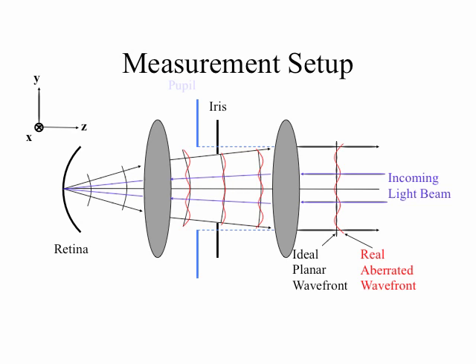Now, the rays of light come off from a single point, and we see our familiar vergence lines here, which are lines that start out at a single point, as opposed to ray tracing lines, which don't. Anyway, these are vergence lines. And let's say that our first landmark coming off of the retina, the first spot that you see to the right, let's say that that's 1 millimeter from the retina, or 1,000th of a meter from the retina. So from that point, rays of light are converging 1,000th of a meter to the left. What does that mean in vergence terms? What's the number that we're going to get?